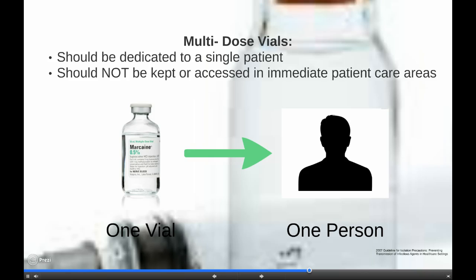If a multi-dose vial enters the immediate patient care area, it should be dedicated to that patient only and discarded after use. A multi-dose vial should be accessed with a new needle and syringe each time, even if the vial is dedicated to a single patient.